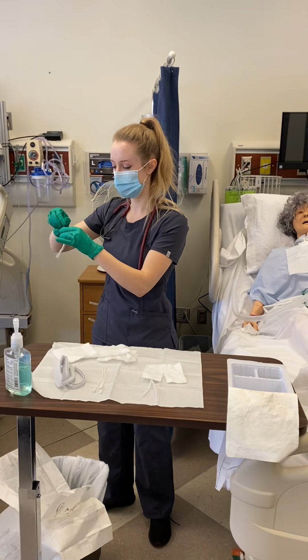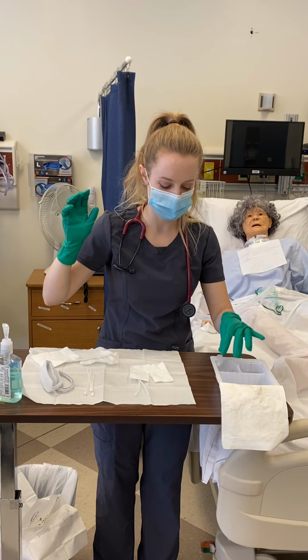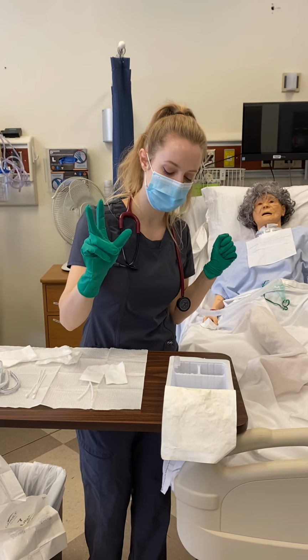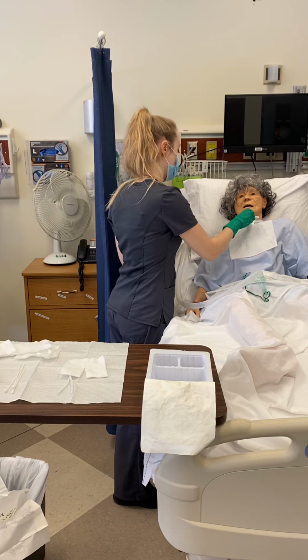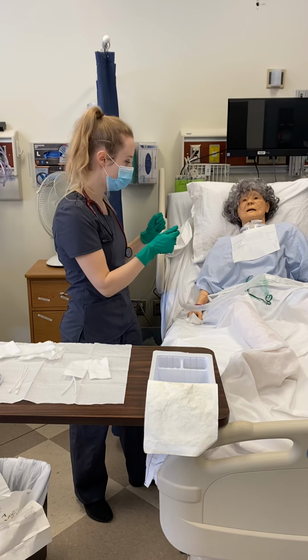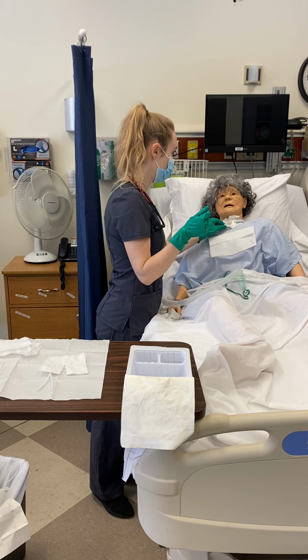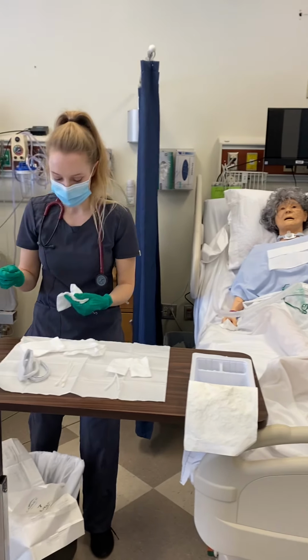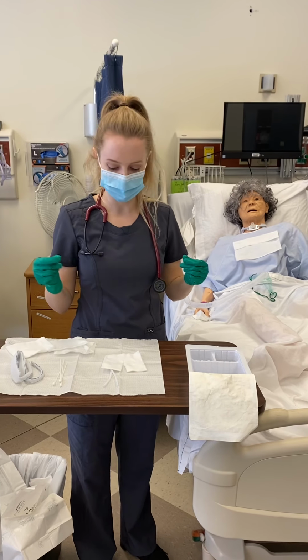I scrub the trach thoroughly and then place it in the second container of saline, which I then take out of the second container of saline with my dominant hand and, being careful to preserve my sterility, reinsert it. Next, I remove the old dressing from around the trach, and I'm observing the tracheostomy site for redness, irritation, secretions. Hopefully I have suctioned all those adequately.